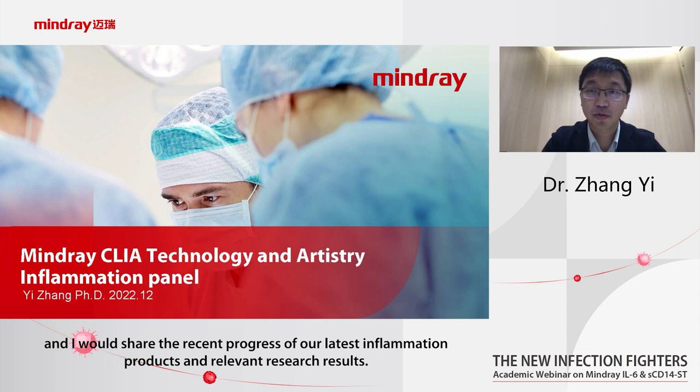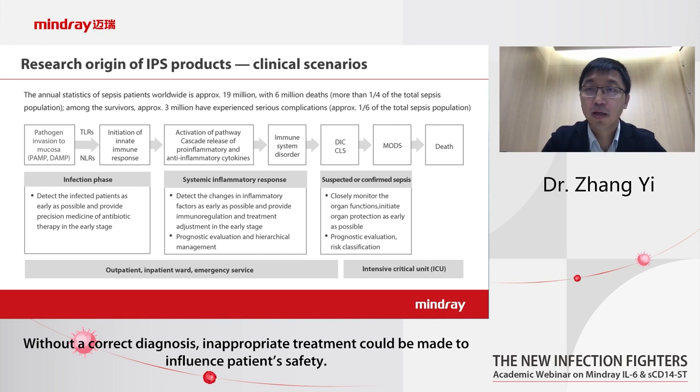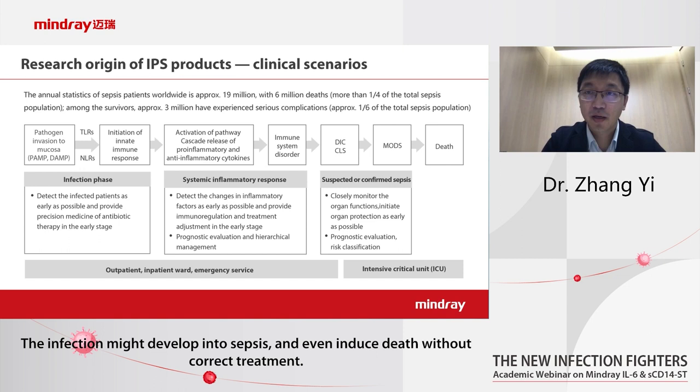Infection is common in people of all ages around the world. However, the signs of infection are not always noticeable, and differentiating them accurately is still a challenge. Without correct diagnosis, inappropriate treatment could be made to influence patients' safety. The infection might develop into sepsis, even induce death without correct treatment. Therefore, how to correctly and timely diagnose and monitor infection is very important.